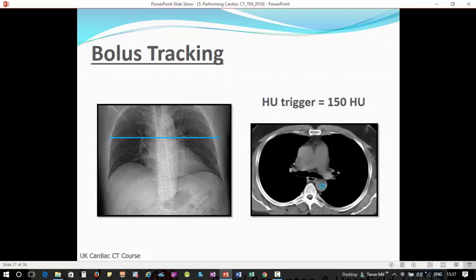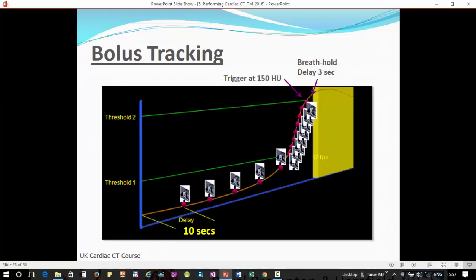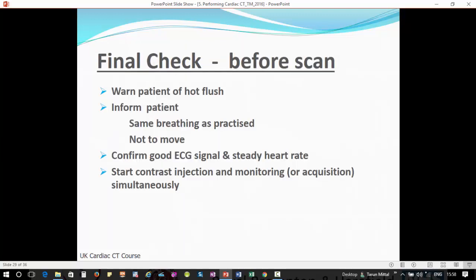Bolus tracking is where you set a region of interest in the vessel of interest. So you may choose the descending or the ascending aorta. We choose ascending if we're going to bolus track the cardiacs, but we don't tend to. And you set a Hounsfield limit at which the region of interest will trigger the scan to start. So once the Hounsfield unit density reaches 150 in that region of interest, it'll trigger the scan to start. There'll be a bit of a delay. It'll do a few monitoring slices and it will continue to monitor until it triggers the scan. There'll be an inherent small delay. Every system has one. It's usually about 3 seconds before it starts the scan.